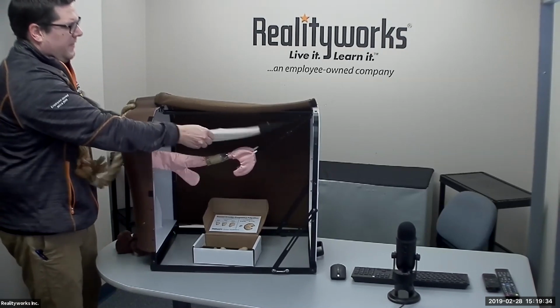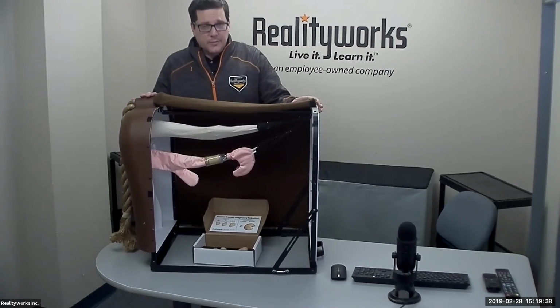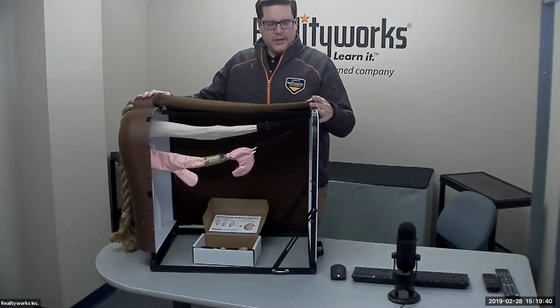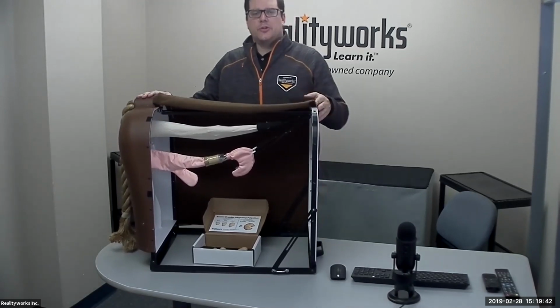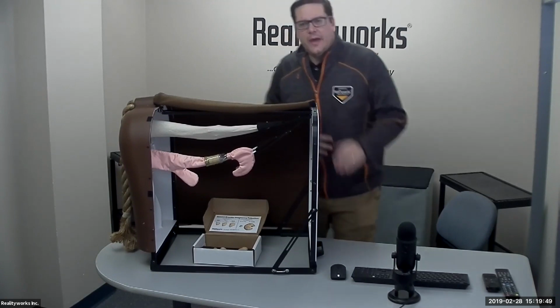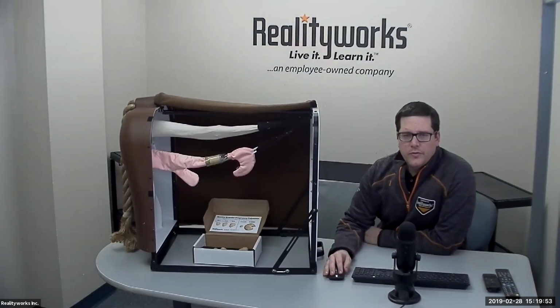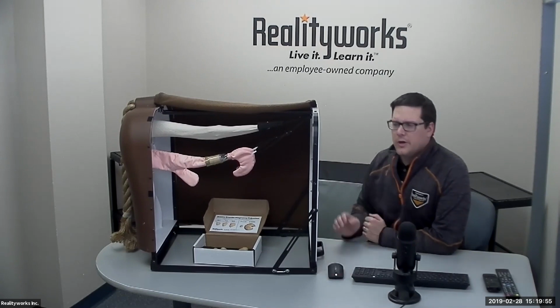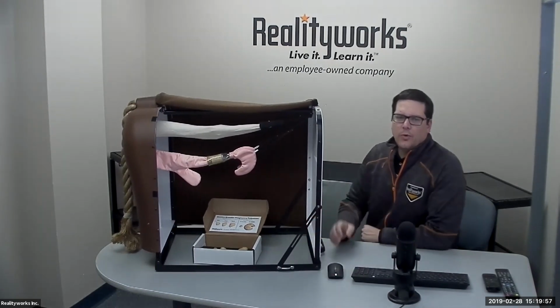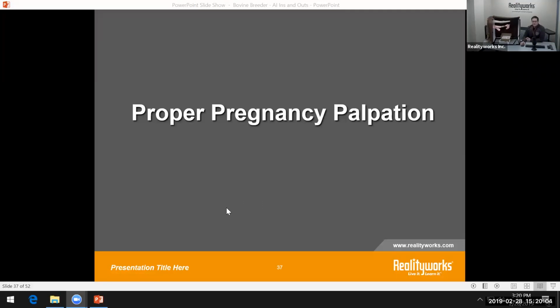All right, now that's just a quick little overview, but there's a lot of different training pieces that you can use with this product with your students, allowing them to do that type of training. That is the overview of how this product can work and what it actually does. Want to go back then, as we were working before, and talk about proper pregnancy palpation.